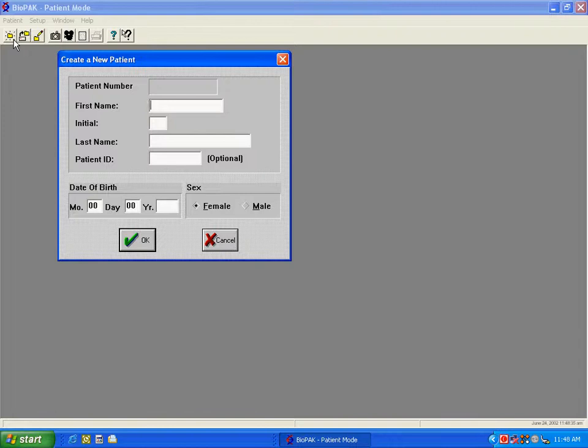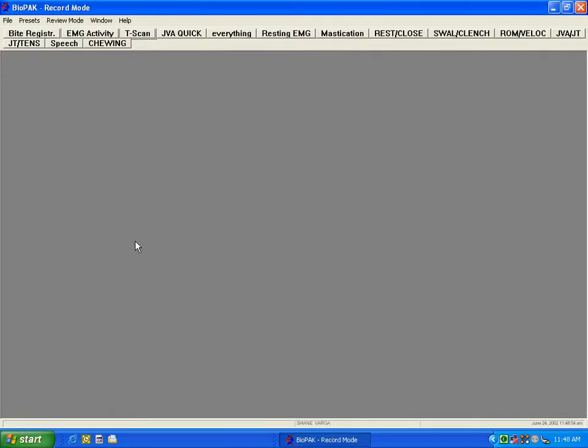We're going to enter a new patient for recording. And your date of birth, Shane? 2/20. Now I've entered Shane as the patient, clicking OK. Because we have no data in Shane's file, he's a new patient, it jumps immediately to the record mode.